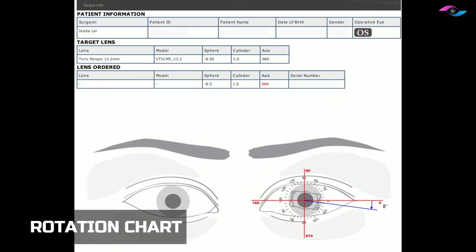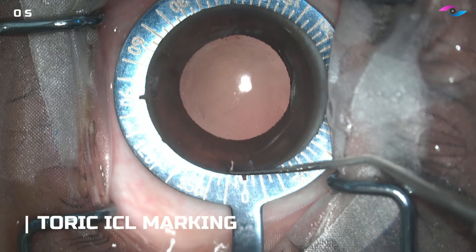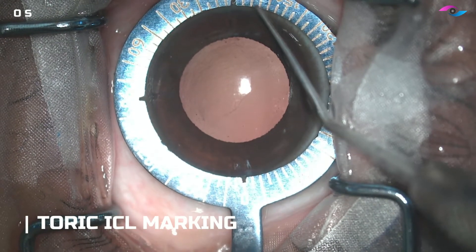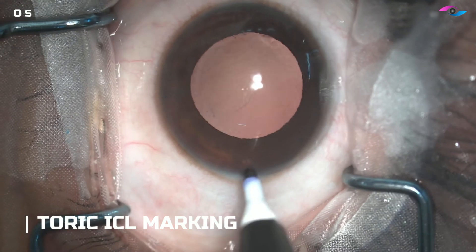This is the rotation chart. We are planning the left eye of the patient and we can see we have to rotate the lens 8 degrees clockwise. We have already pre-marked the patient on the slit lamp, and now I am just marking the 8-degree orientation marks.